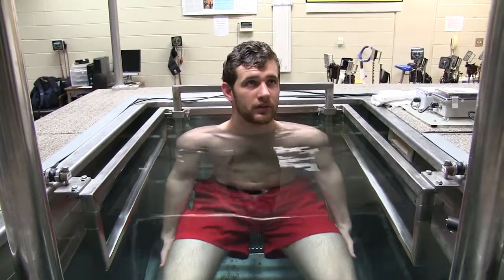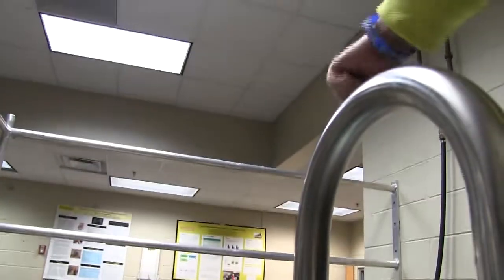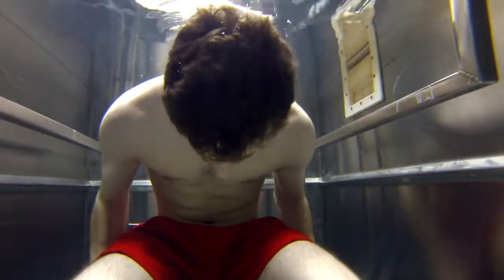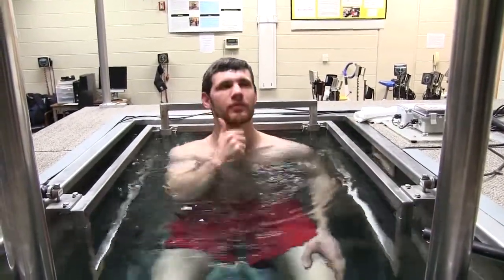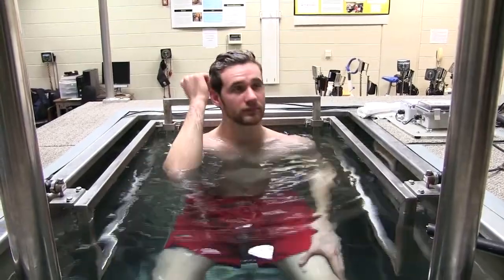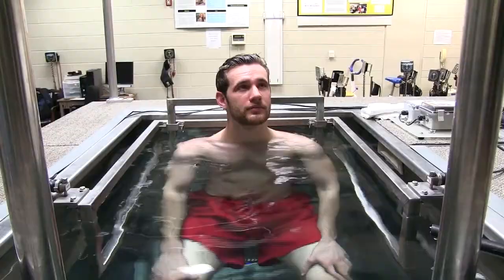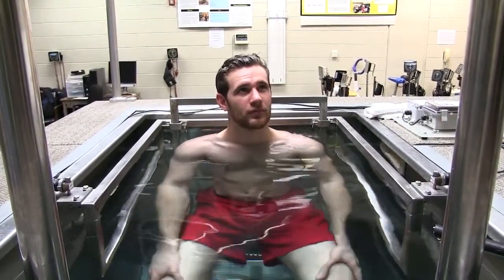When it's time to come back up, I'm going to knock on this metal part right here — do you want to hear what that sounds like under the water? So when you hear that knock, it's time to come up. If at any point you feel like you can't stay under any longer — it shouldn't be more than a few seconds — you can come up. I don't want you to drown because then I'll have to come and save you.